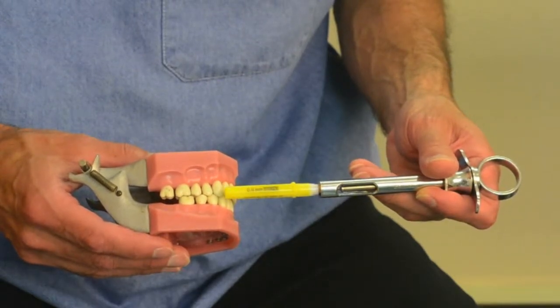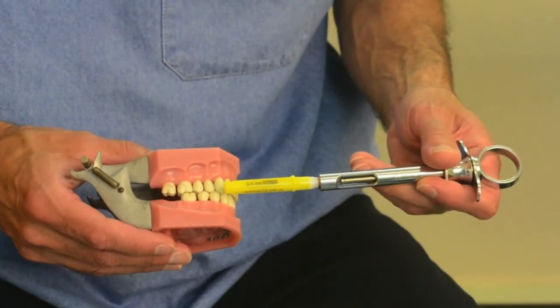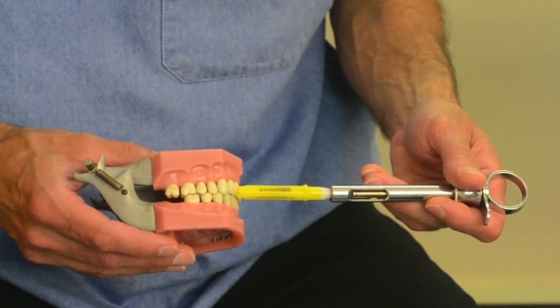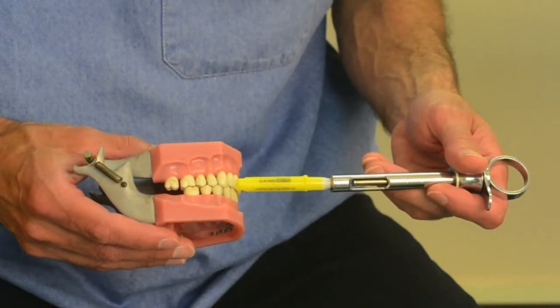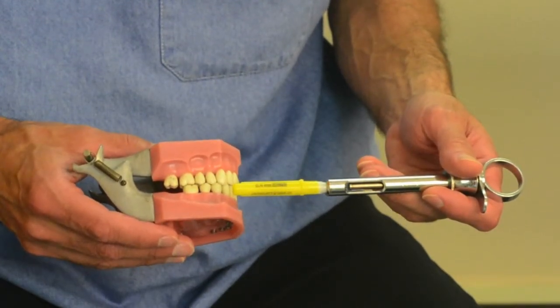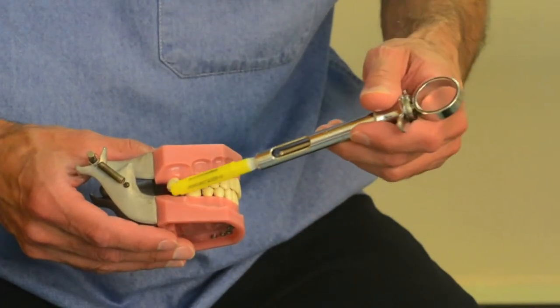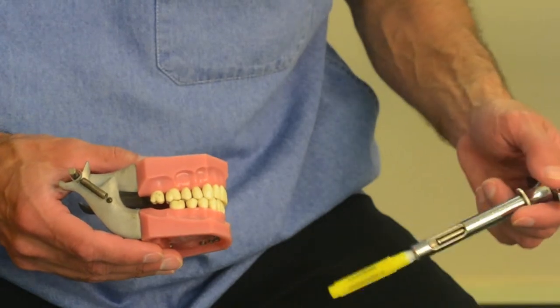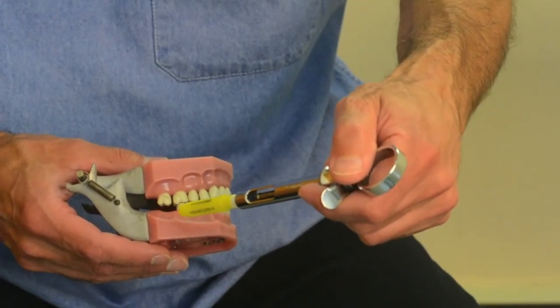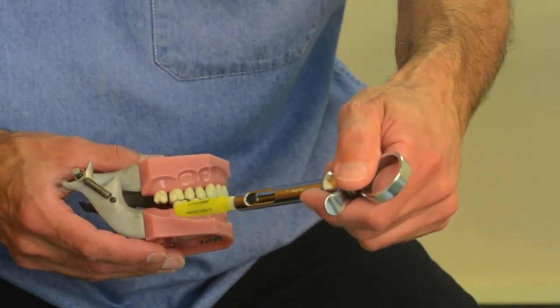As far as anesthetic agent of choice, I tend to use a non-epinephrine containing anesthetic for the block injections, but for the infiltrations I use an epinephrine-containing anesthetic. Perhaps the best anesthetic to use is articaine (septicane), because not only does it contain epinephrine, but it also tends to diffuse very rapidly through tissues. For the infiltration, I locate the fracture site — be it the angle, body, parasymphysis, or symphysis area — insert the needle into the area, and try to feel the crack of the fracture itself. Once identified, you inject into or as close as possible to the fracture.